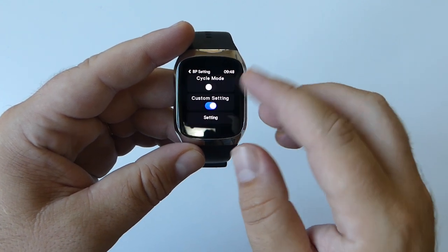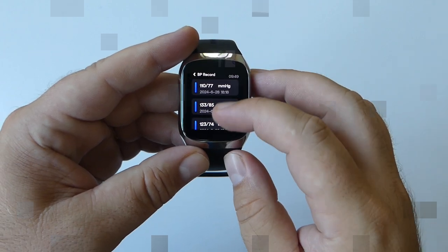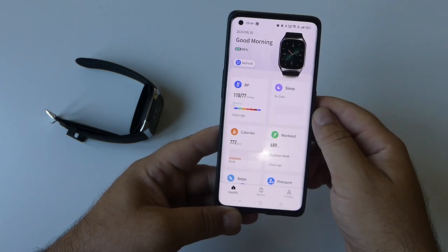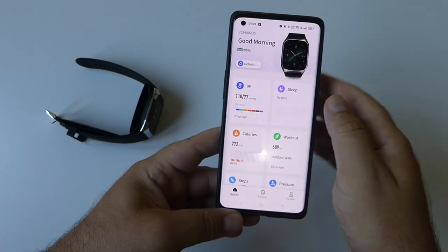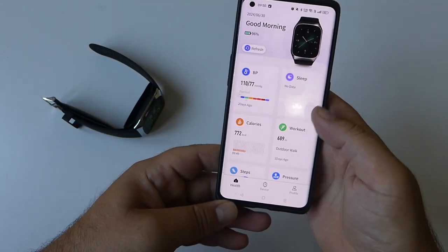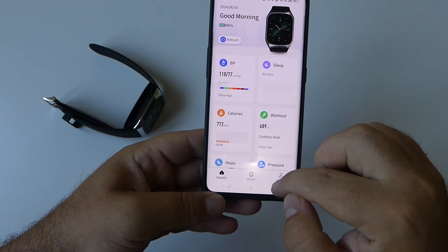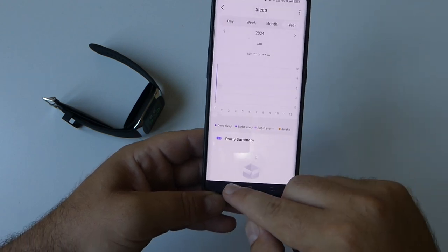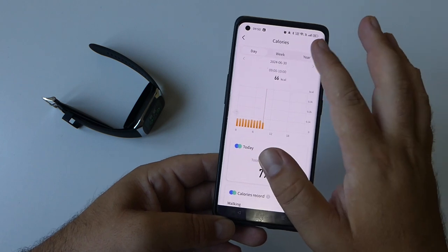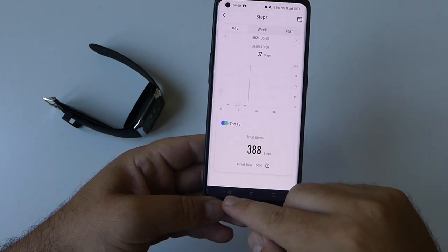The BP Doctor app syncs your blood pressure changes, activity indicators, and sleep sessions into charts and diagrams you can check anytime, providing better insights into your overall health to help develop a treatment plan or improve your lifestyle. To install the app, download it from the app store, register, and sync the watch with your phone. In the app you'll have full access to detailed blood pressure analytics by day, week, month, and year, plus sleep data including deep sleep, light sleep, REM, and awake periods, as well as total calories and step count.